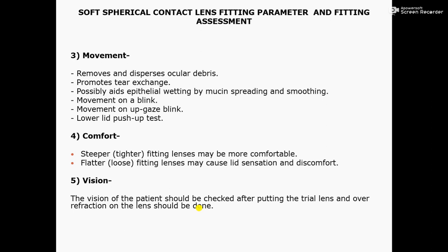Here, after inserting the contact lens, we have to notice the contact lens movement, whether tight or free. We will move the lens vertically through push-up on the lower eyelid. After moving the lens vertically, we have to notice whether the contact lens can come back to center or not. After that, the practitioner mainly assesses how fast and without any difficulty it came back to its original position or center of the eye.